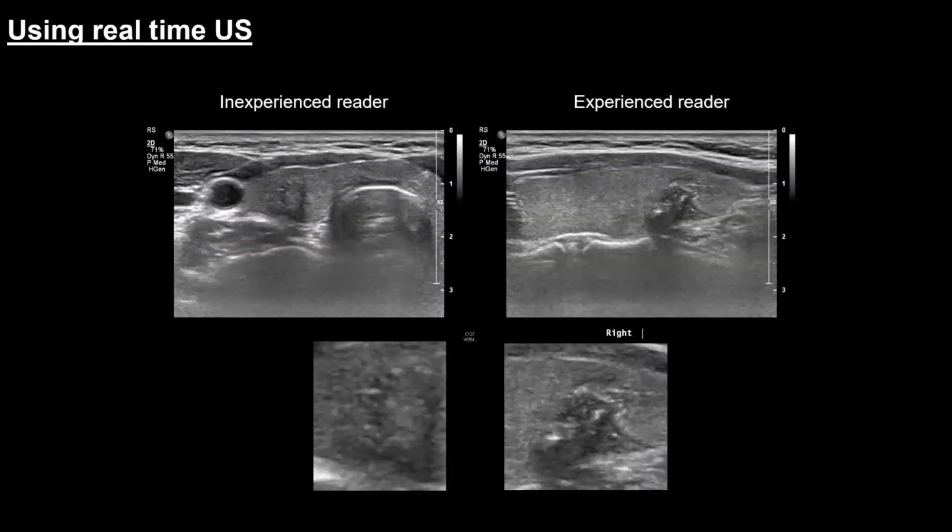This image here is not a comparison of static images. Two physicians performed real-time ultrasound on the same nodule and saved what each physician regarded as a representative image of the nodule. One physician thought this picture was a representative image. The other selected this image.